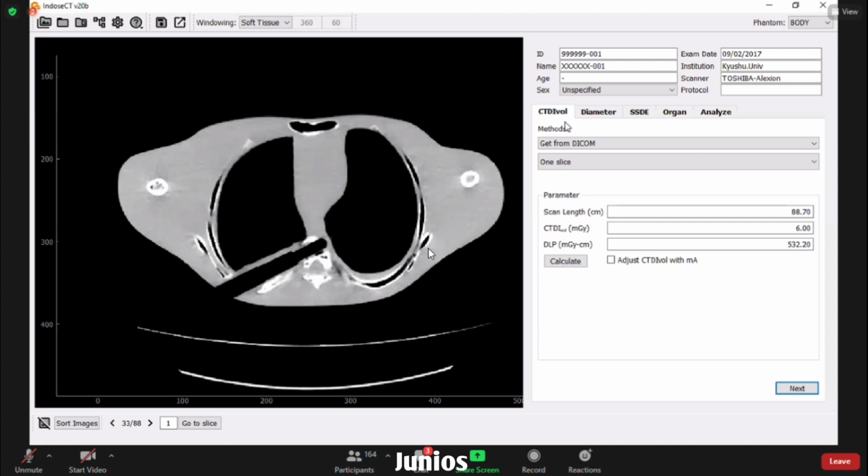Okay, sir. And then from Mr. Gonggong: sometimes the operator renames the patient name on the console, so those records are captured and the report is lost. Can the application still get information using the feature to get from DICOM, if we only copy the image DICOM from the machine? Yes, this CT automatically gets the information of the patient, and the information is displayed here. However, in this workshop, I should erase the name of the patient for ethical reasons.